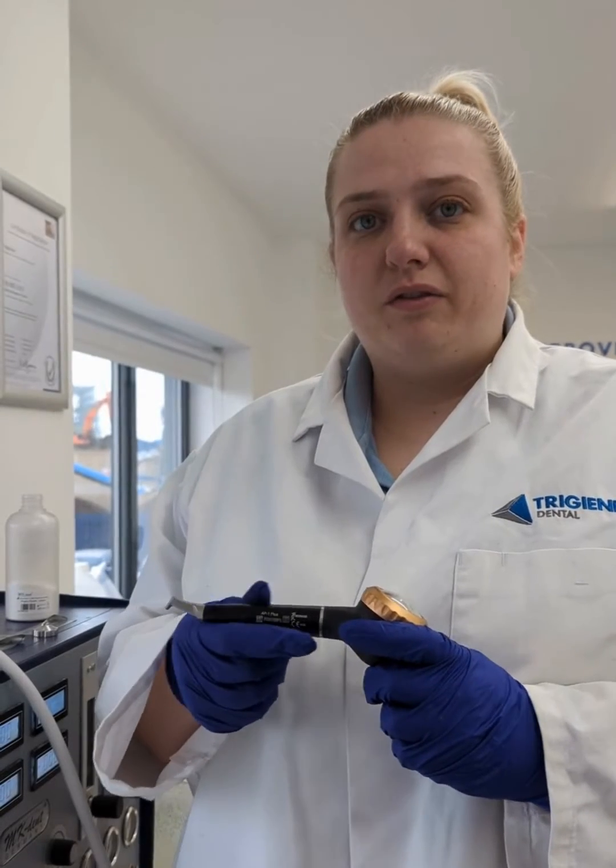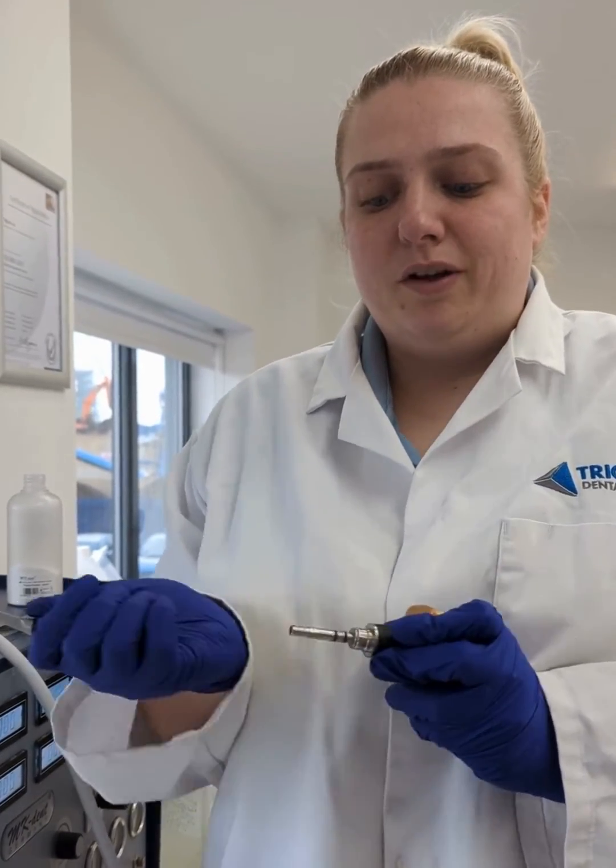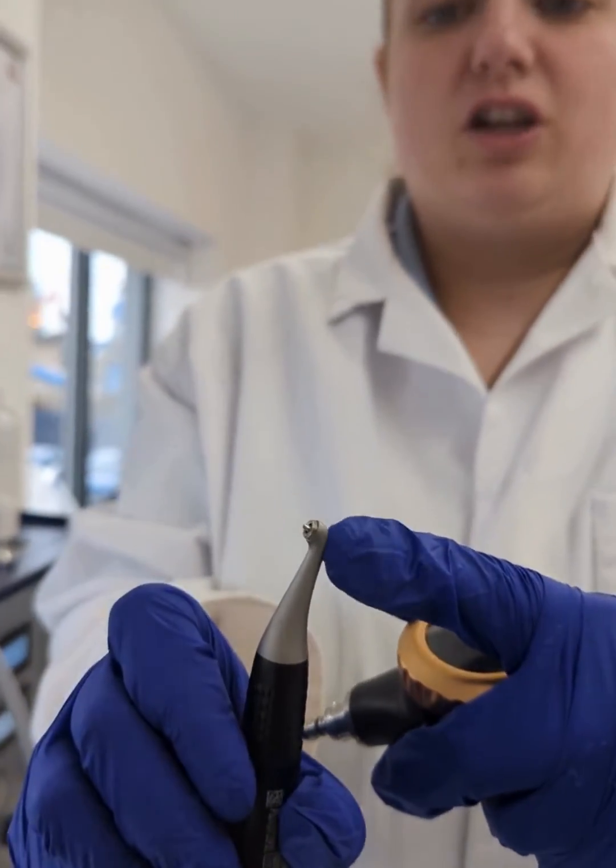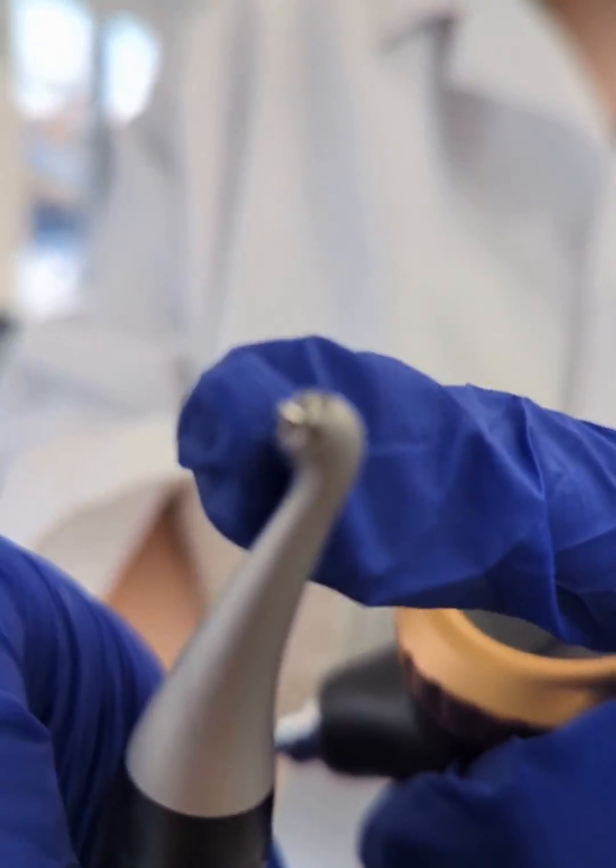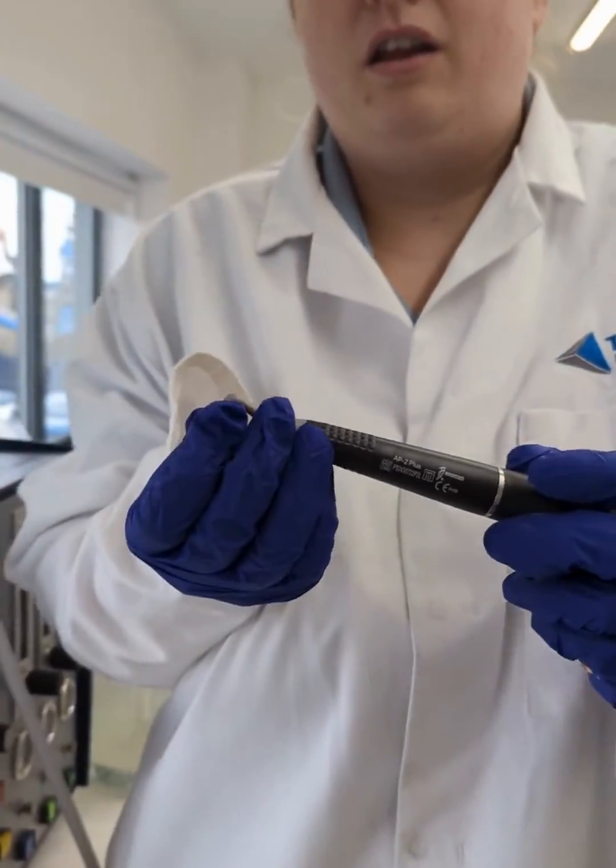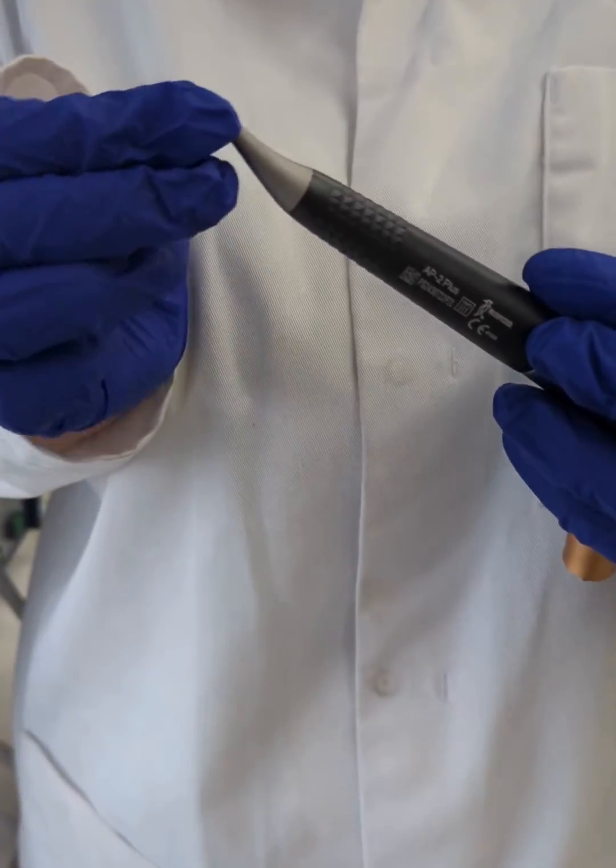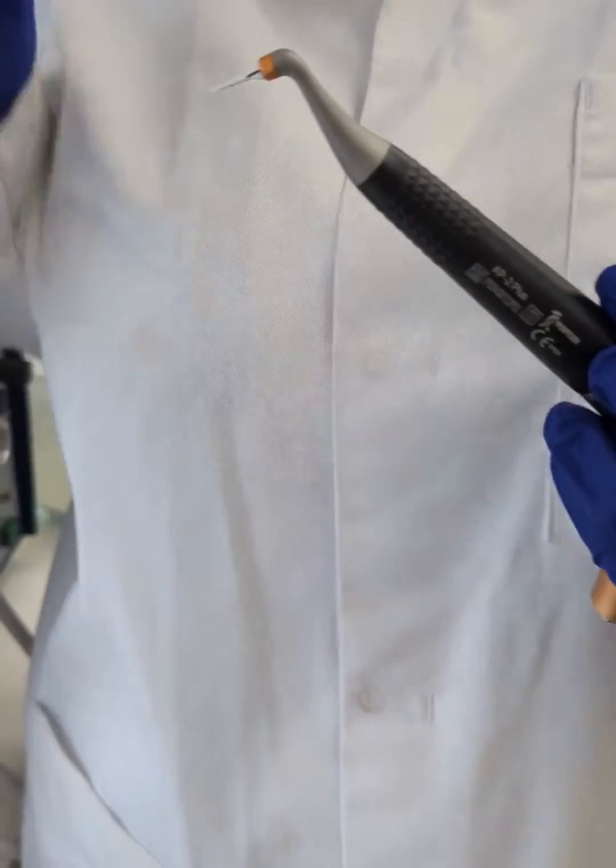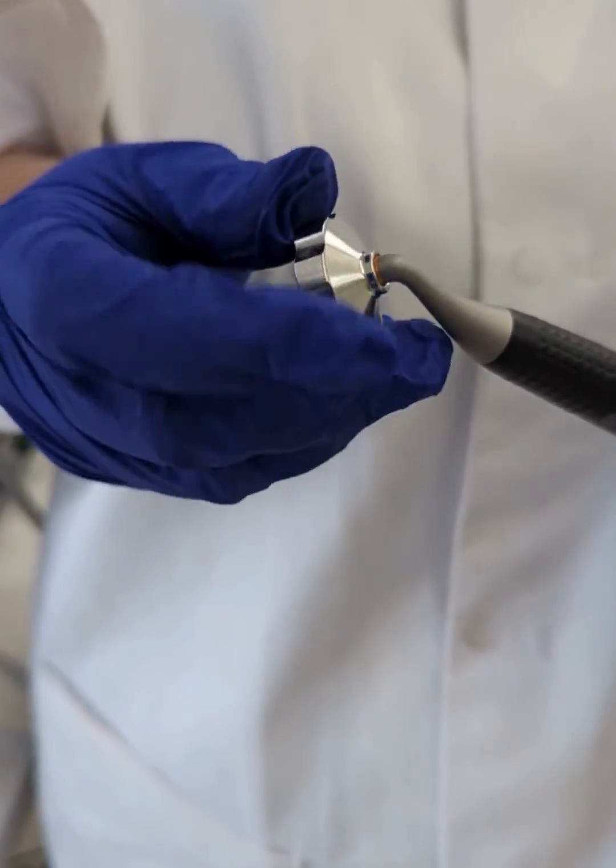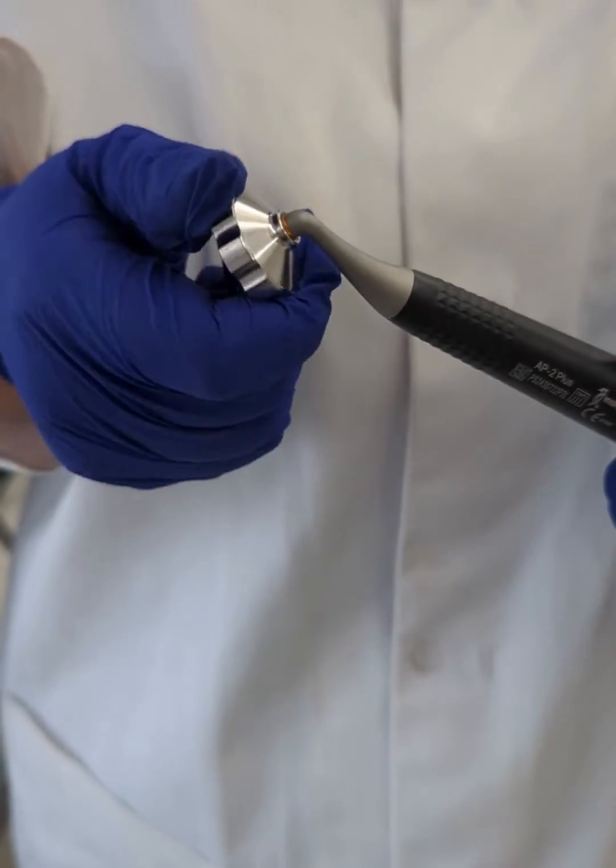When you start with the perio, you need to remove the prophy handpiece and you will use the perio button. As you can see at the top here, it has an attachment for the tips that you need to use, which do come with the handpiece. So just attach that and it comes with a little tightening tool in the box here. So you can just tighten that in place, ready for use.